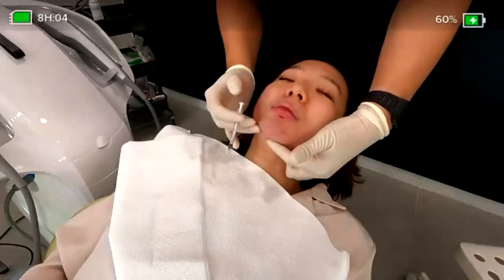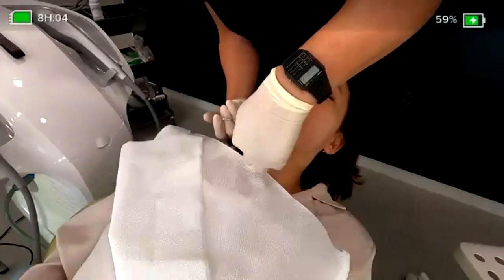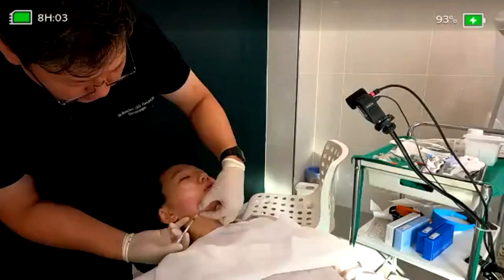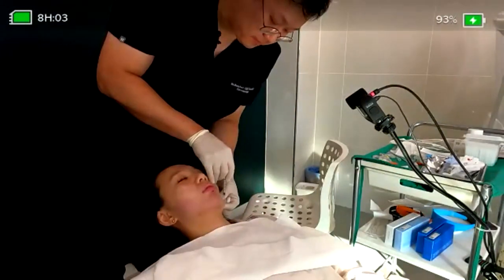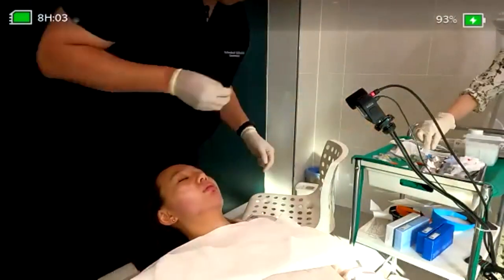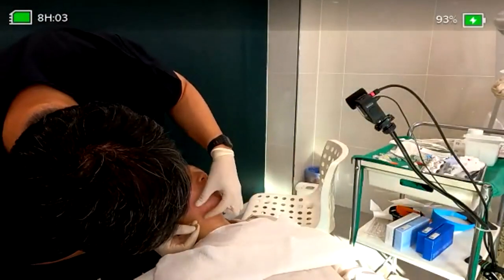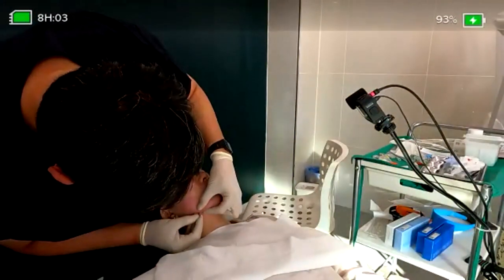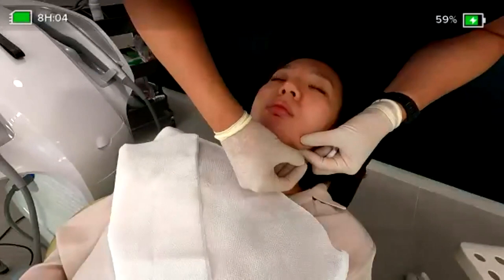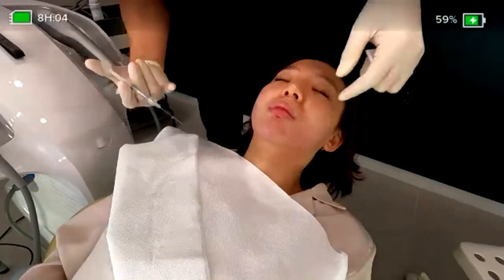Maybe we can just approach from here to here, but usually this angle is a little sensitive, so we will make a mandibular angle downward here with a pinching up, and pinching up. Here, continue. Also here. And for smaller volumes.